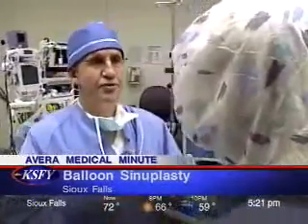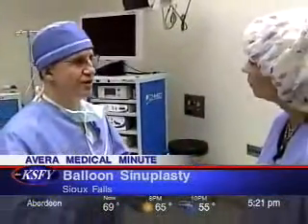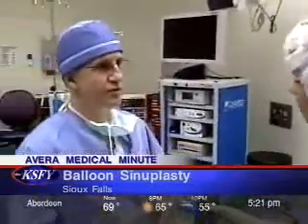The concept of surgery over the years has been to be as little invasive as possible. With the balloon sinuplasty, we actually aren't removing any tissue at all, but merely pushing things out of the way. When you remove tissue, it increases the likelihood of scar tissue forming, which can often cause a reobstruction of the sinus drainage pathways. And this is probably less invasive because you go up through the nose? Right. Less invasive, less trauma to the tissues, less recovery time, less bleeding.